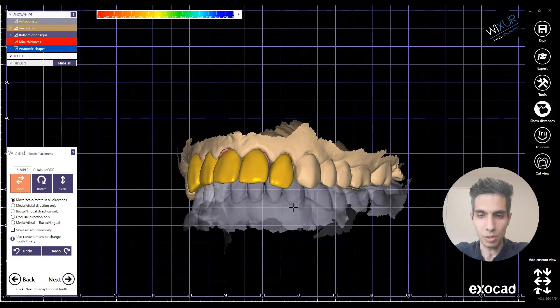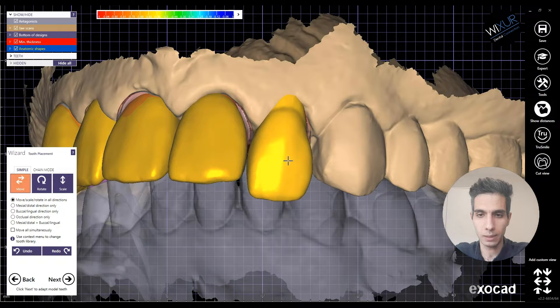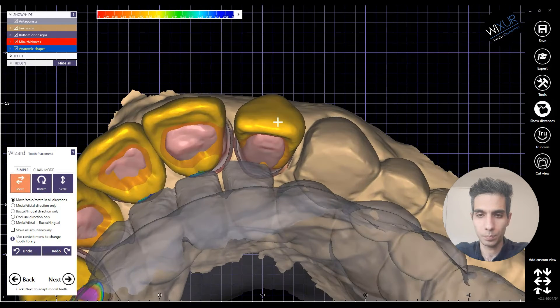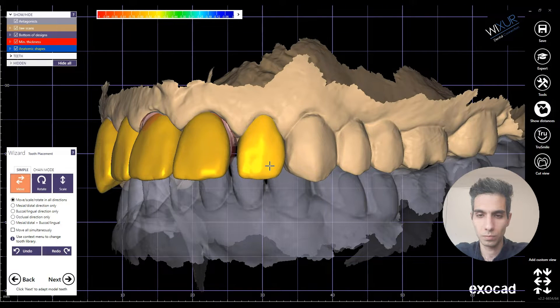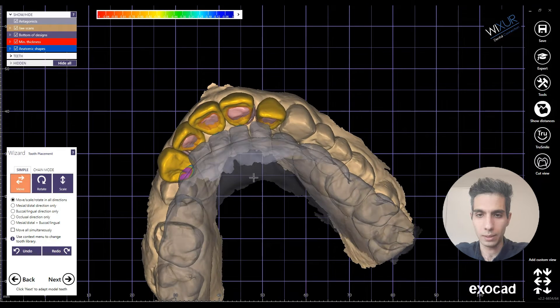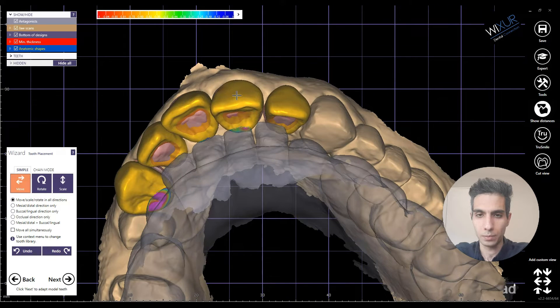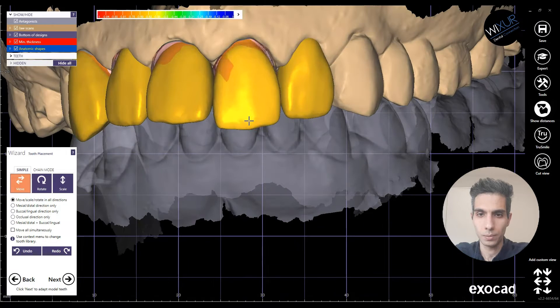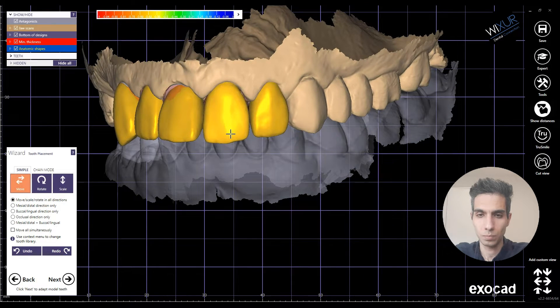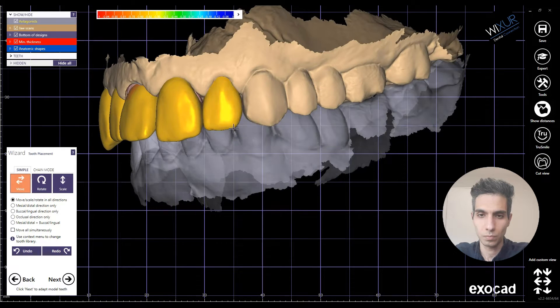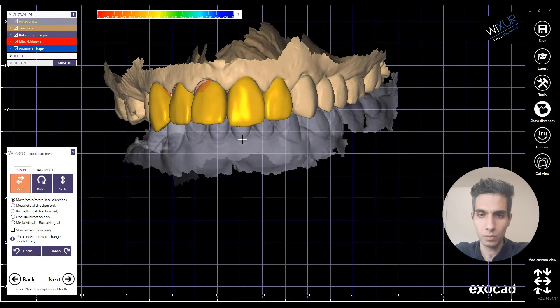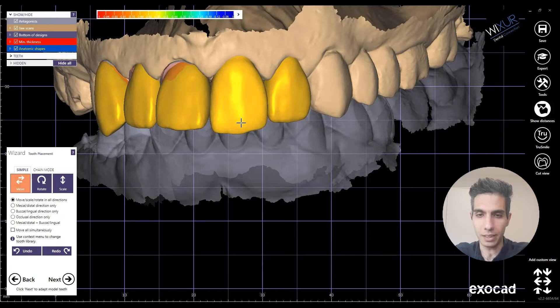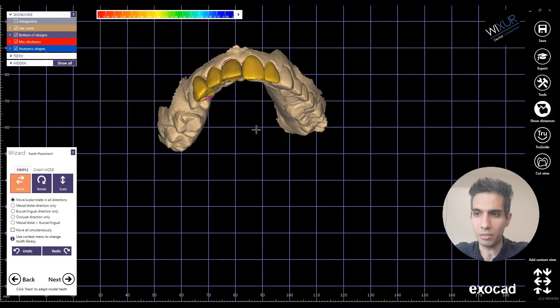Now we are going to start the tooth placement. Just a little bit here — using it for the lateral here. Always use the hotkeys to design faster and smoother. I also explained hotkeys in a different video.